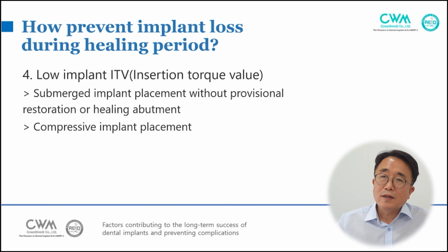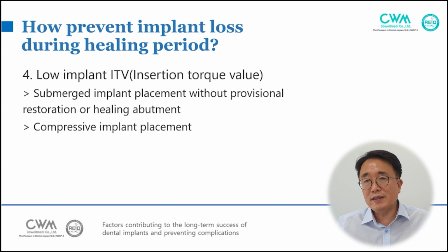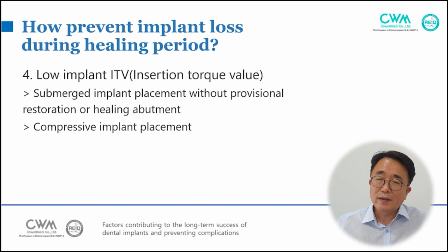So, pause. Low implant insertion torque has to be prevented by submerged implant placement without provisional restoration or healing abutment. And we have to use compressive implant placement.